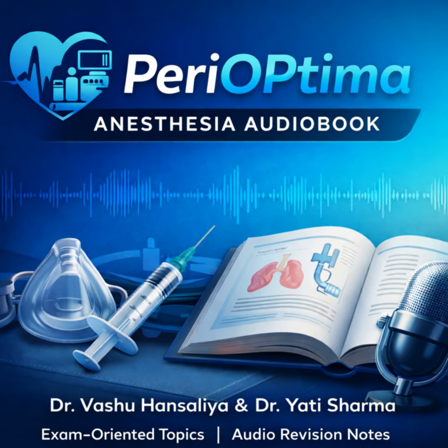The scope is useless if you can't see. We have some troubleshooting tricks, but if there's a lot of blood, the procedure will fail, and you have to move on immediately. And total airway collapse. If you encounter a complete airway obstruction, FOI is absolutely contraindicated. Remember, FOI is for a patent airway that's difficult to intubate. If it's completely obstructed and you can't ventilate, you move to an immediate surgical airway, a cricothyrotomy. Using the FOB here is just wasting critical time.